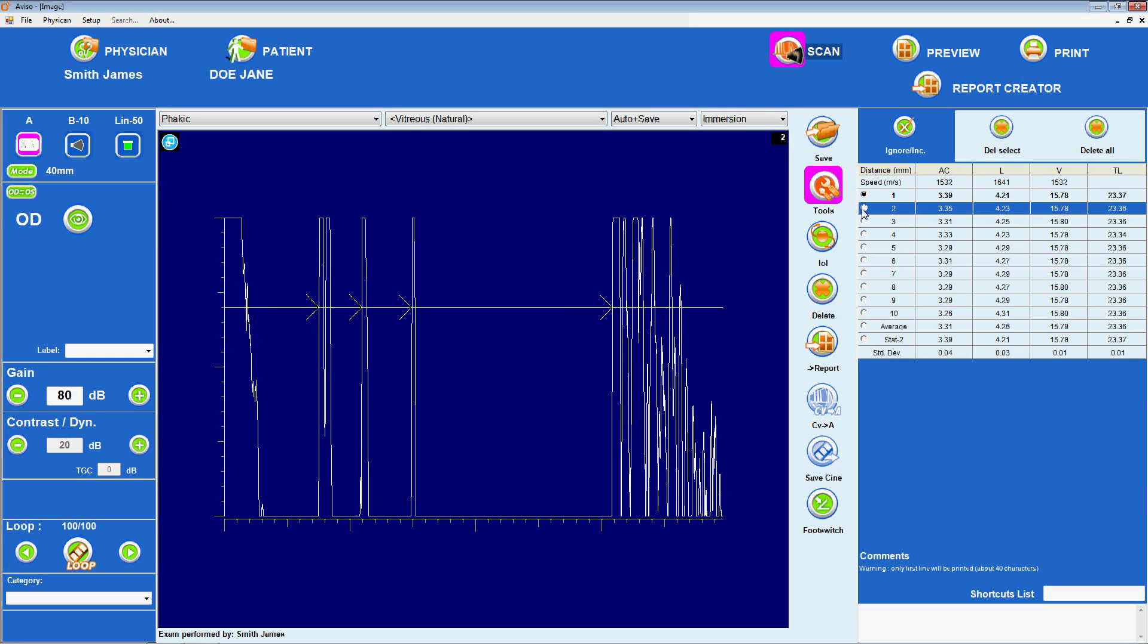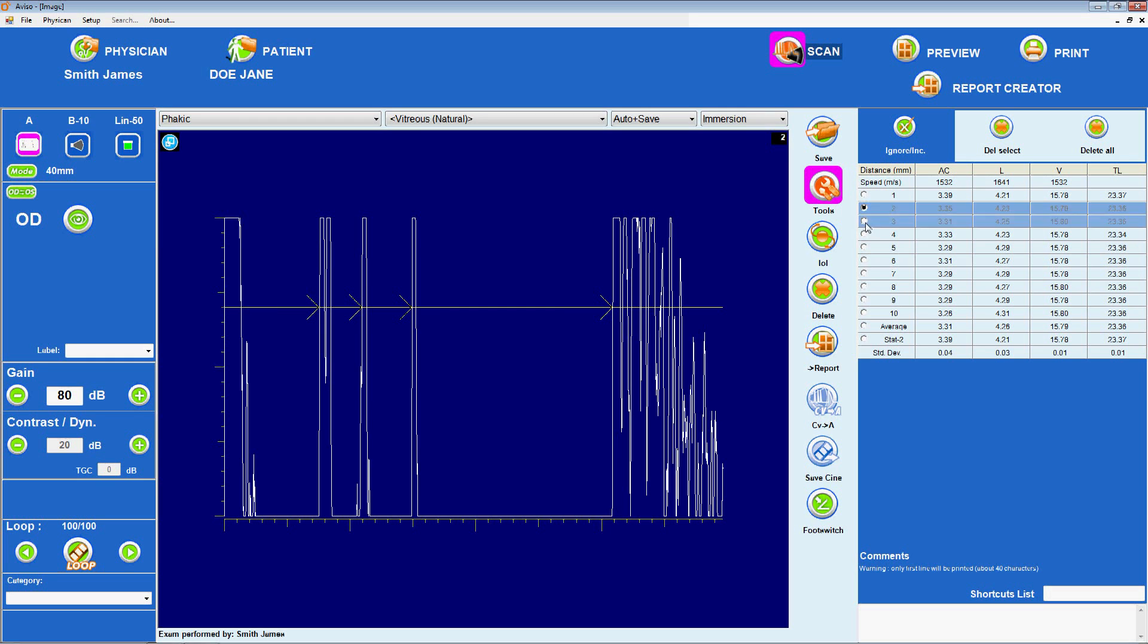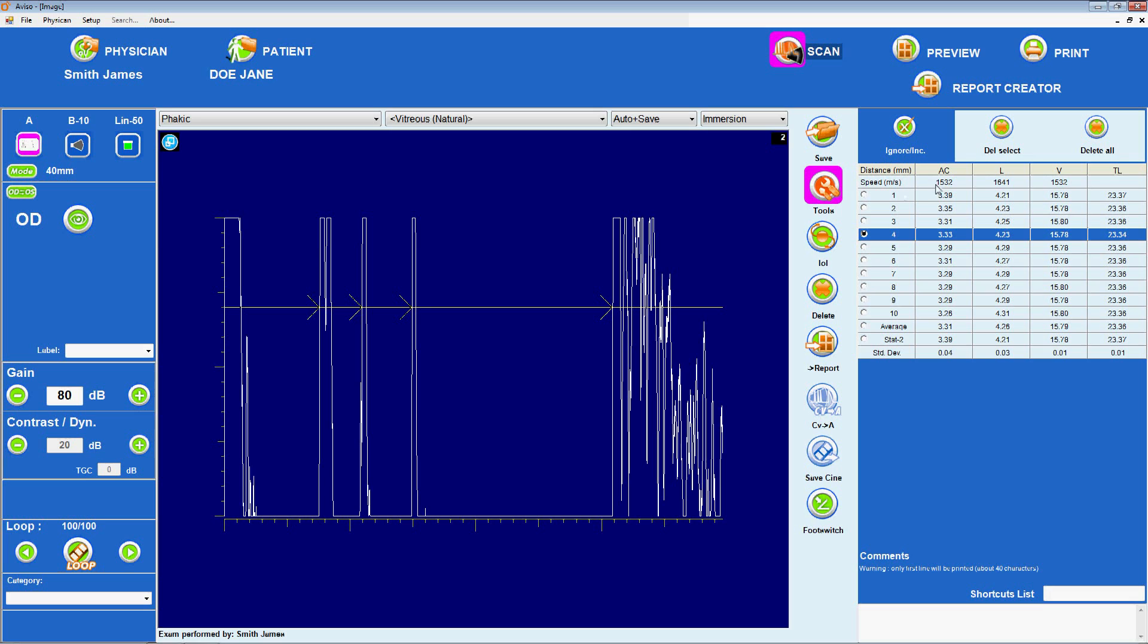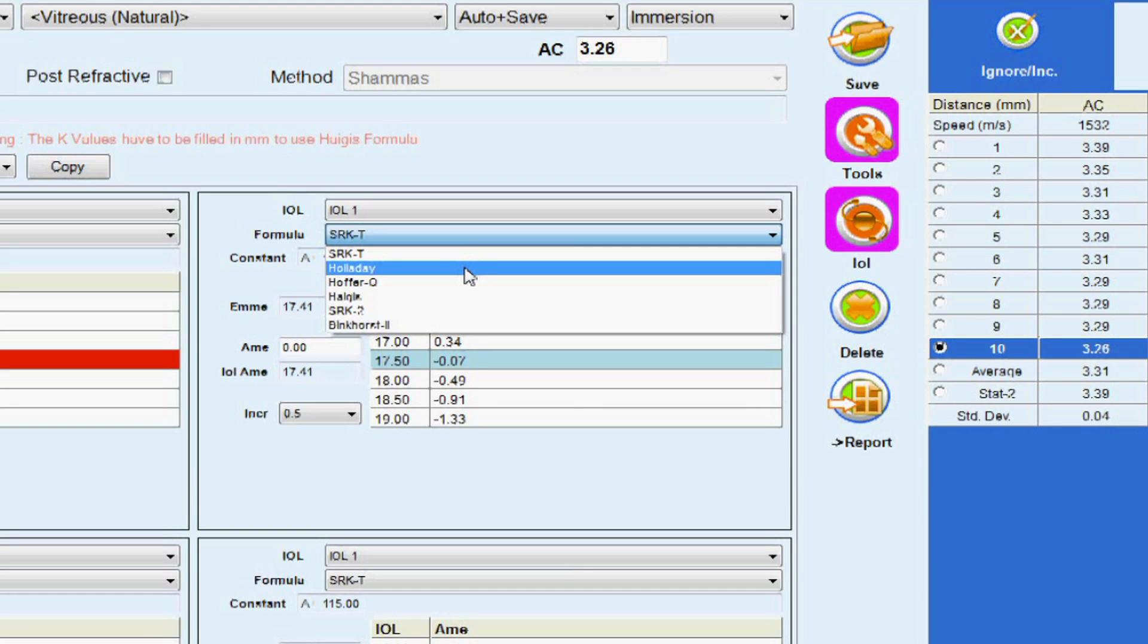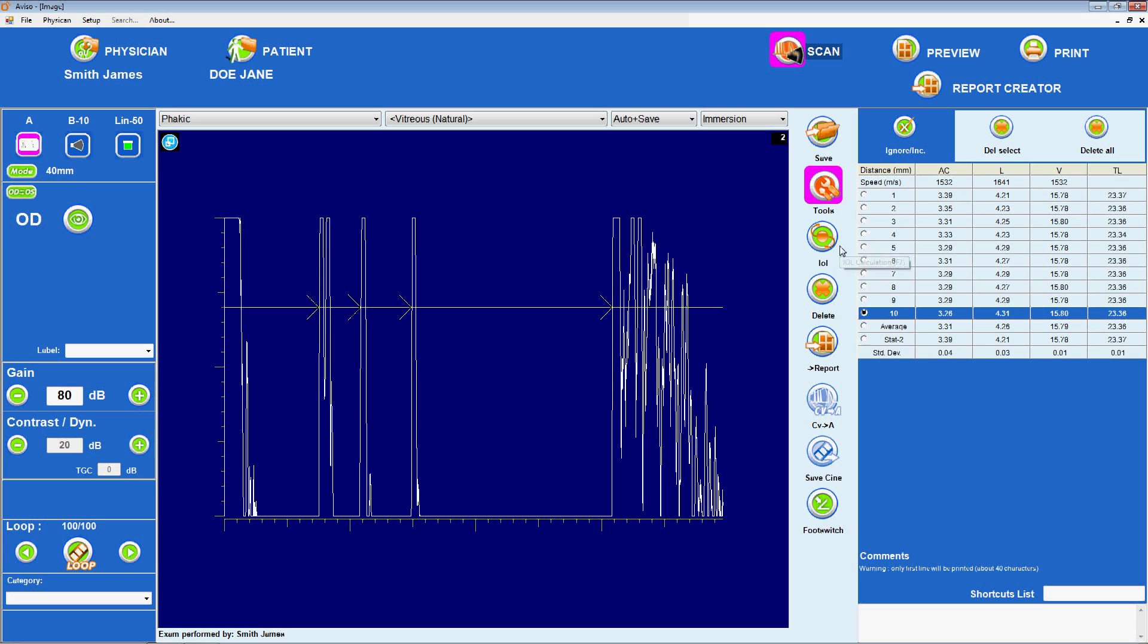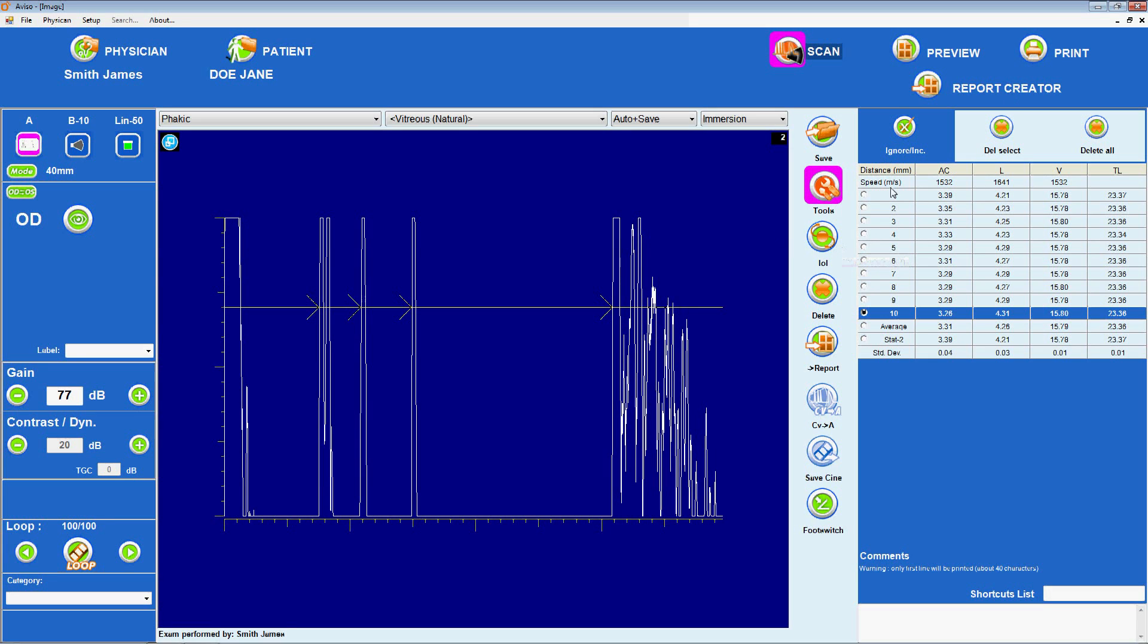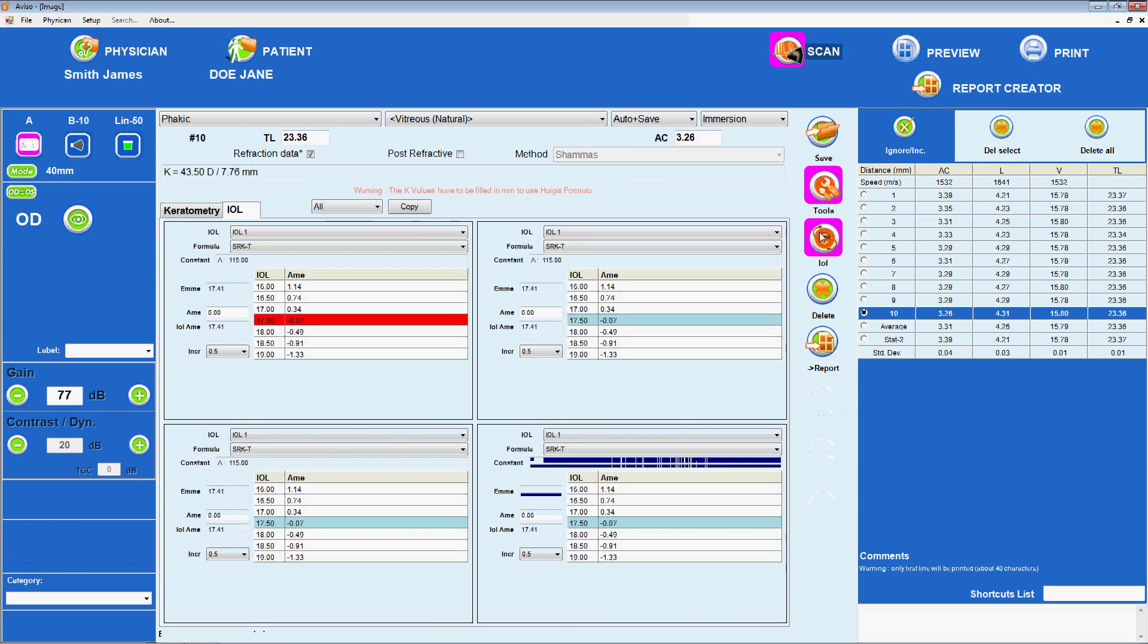It is critical to examine the total axial length and anterior chamber measurements for consistency. The standard deviations for each should not exceed 0.1. Then perform the calculation using the desired two-variable formula, SRKT, Holliday, or Hoffer-Q.